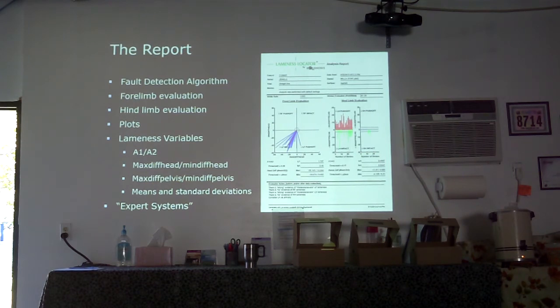There's no severe because you don't need that. So the horse is basically acting as its own control, as a symmetric movement. What you're measuring is the asymmetries. Is normal gait symmetric or asymmetric? Normal is symmetric, for sure. Well, because the debate is also there's some hypothesis that normal gait is not symmetric all the time, right? There's some asymmetries. Do we know what is the strength of the assertion that gait is symmetric? Yeah, that's what those thresholds are for.